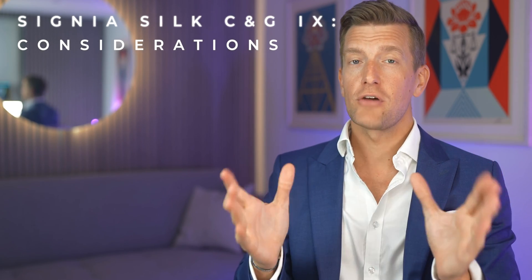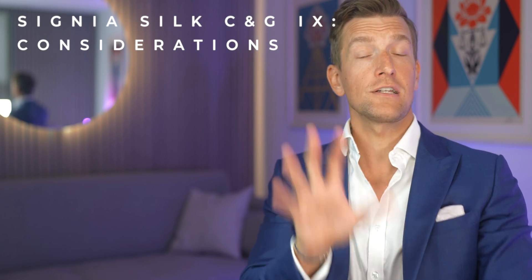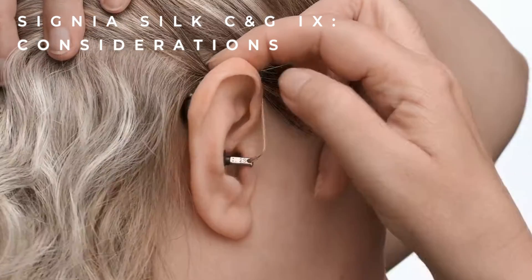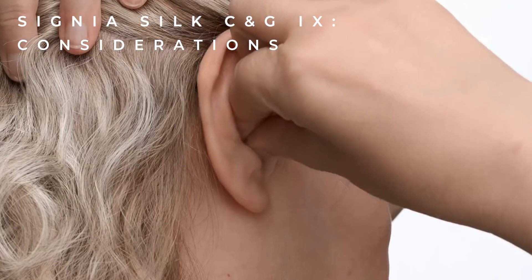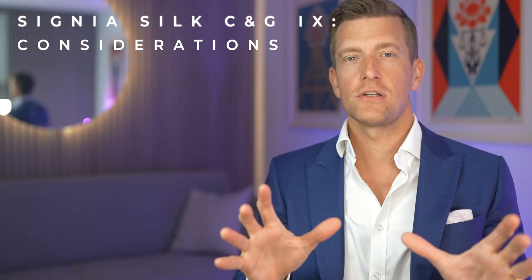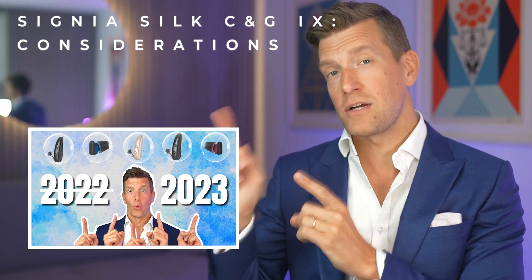I've shared a lot of positives today, but this video wouldn't be a balanced review without a thorough understanding of what's missing from the Signia Silks. Starting with background noise: Signia utilised their one-mic directionality technology and the pinna effect, but the Silks won't cope as well as a receiver-in-canal behind-the-ear hearing aid, which has multiple microphones to help identify background noise and direction. If background noise is one of your biggest challenges, I would recommend looking at the Pure Charge & Go iX, which is the behind-the-ear model.